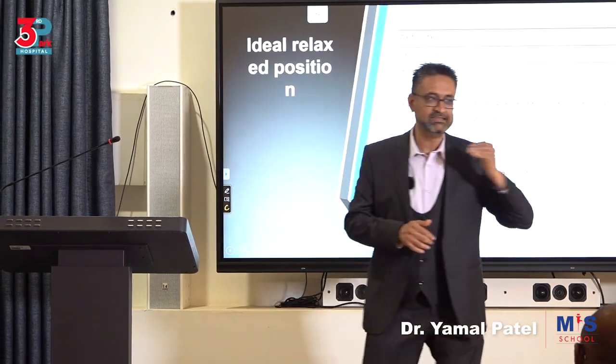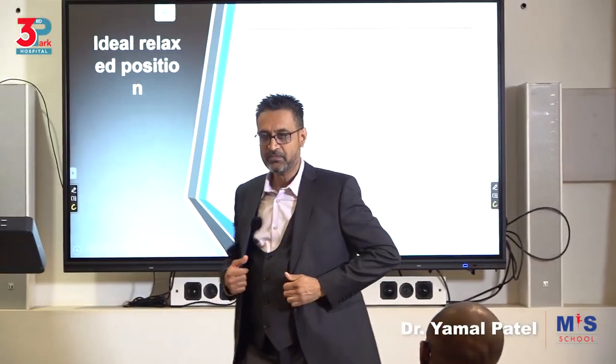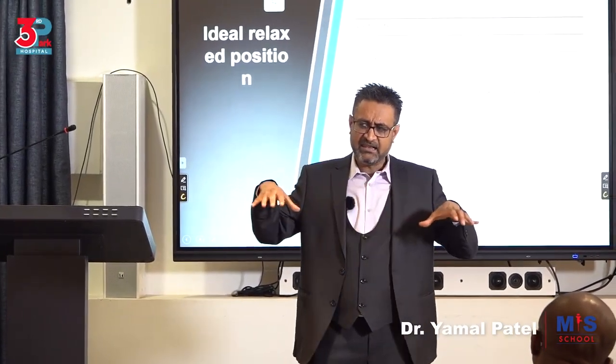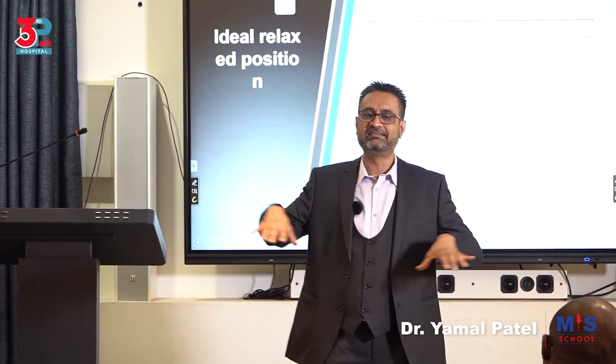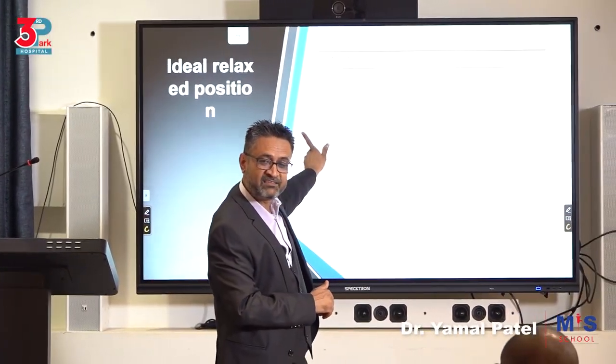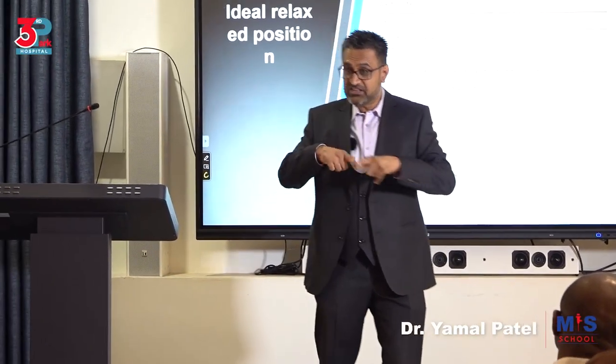The monitor distance should not be this close, right? The monitor distance should be a certain distance. When you go to a movie theater, those of us who may have noticed, what will you see? A certain level of theater movie ticket size seats disappear first. Not the balcony. The balcony is just expensive for people who want to spend money and sit behind there. That's fine. But the seats that will disappear first is FGH. FGH lines will disappear very fast.